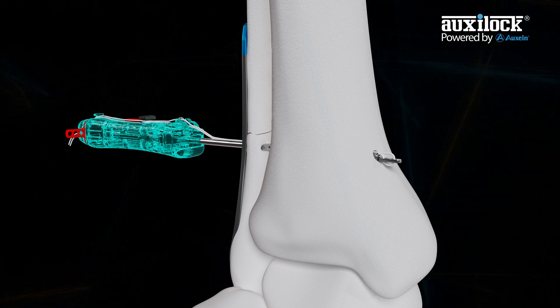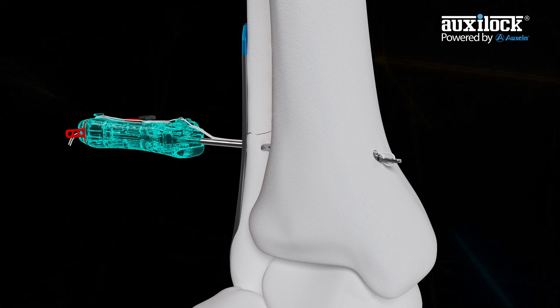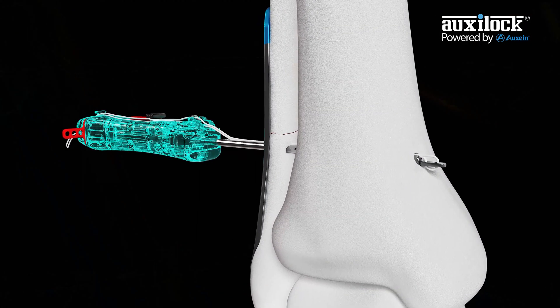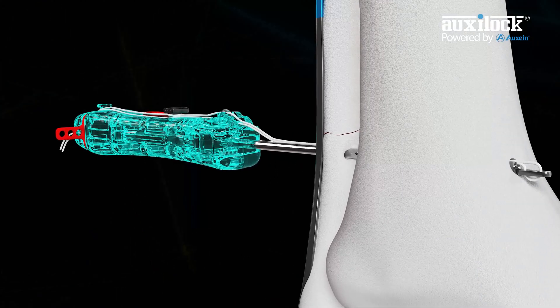Position the black button on the blue handle inserter cephalad or caudad. This will ensure that the ultimate button will be positioned in line with the axis of the tibia after deployment.